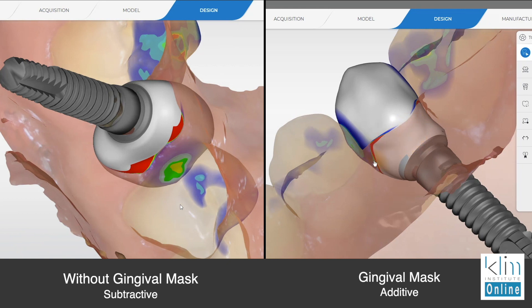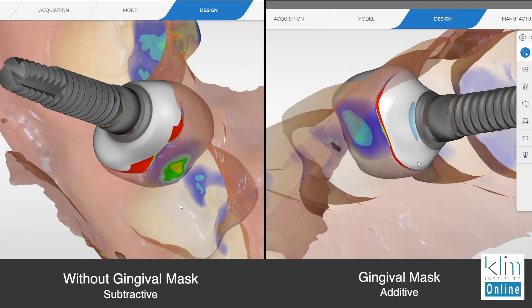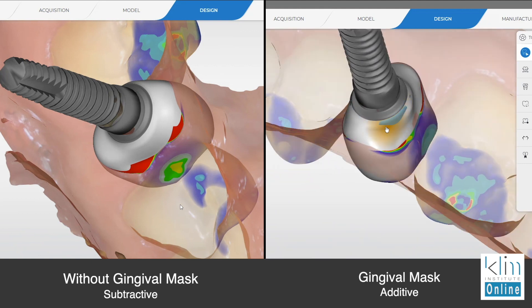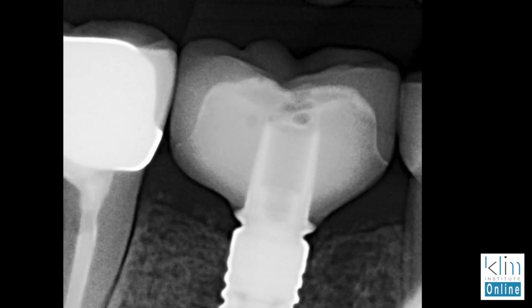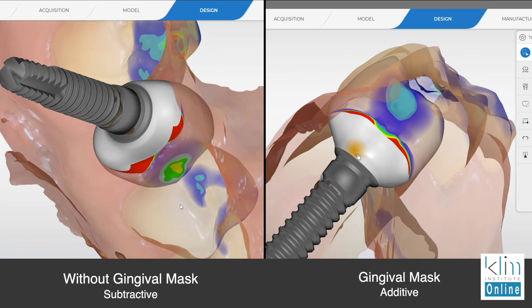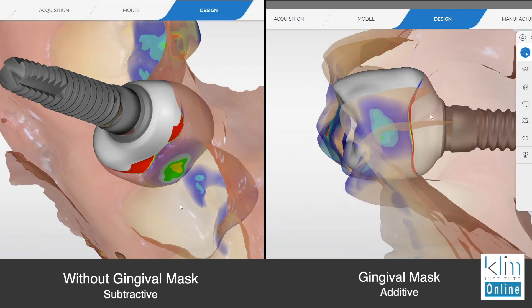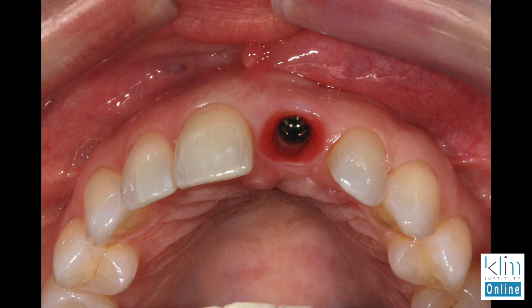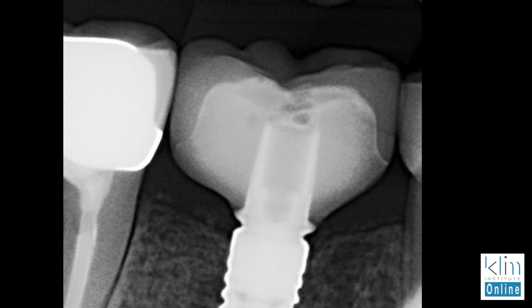With the gingival mask on the right, it does take more time. I use the gingival mask when I've preformed the sulcus, or if I have a really thin biotype, or if I don't have a lot of biotype — in other words, the implant is at the bone and we have to create a fuller emergence. That's when I'm going to use the baseline and soft tissue. This is a good illustration to show you both techniques: a subtractive technique without the gingival mask — which in most cases is what I use now — and if we have a pre-formed sulcus that looks good, or an implant that's not really buried sub-gingivally, it's at the bone or slightly above the bone, then I'm going to use a gingival mask, which will be more effective in creating that sub-gingival emergence.